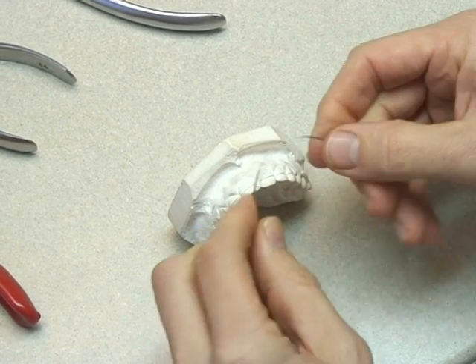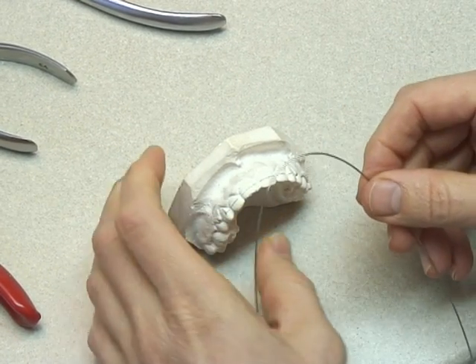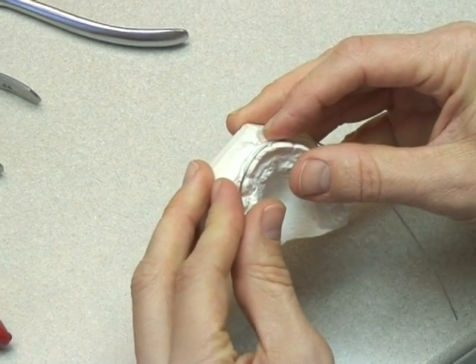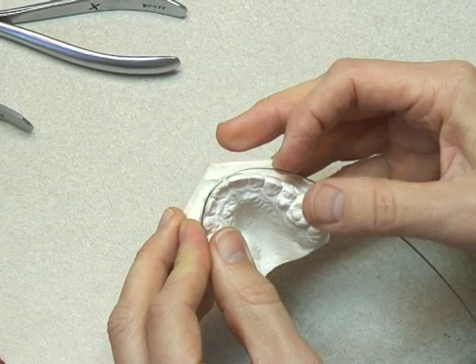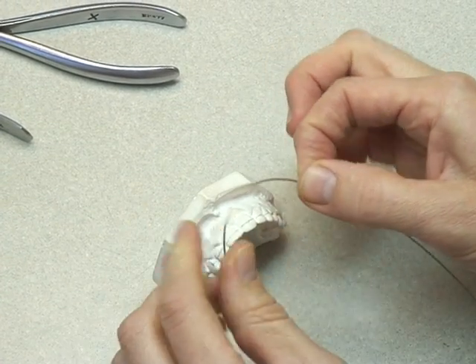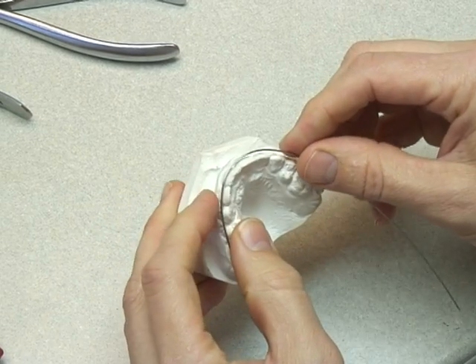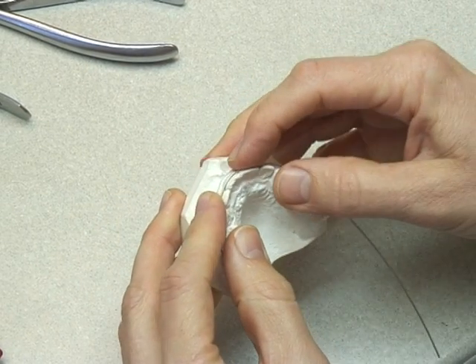So with some 0.7 mm wire, we form it with our fingers. No need to use pliers here — some people do, but you can use your fingers and thumbs just to create a shape that's a nice uniform arch that fits around the teeth in question and just contacts.